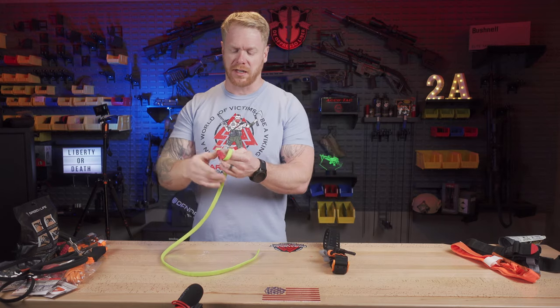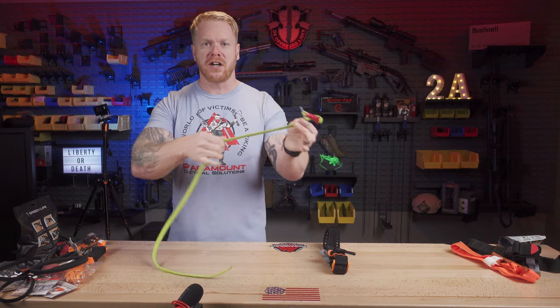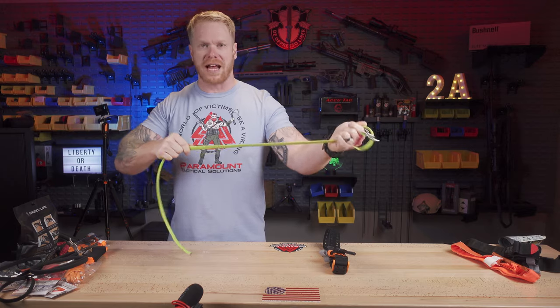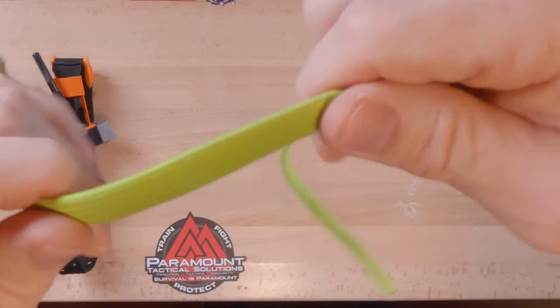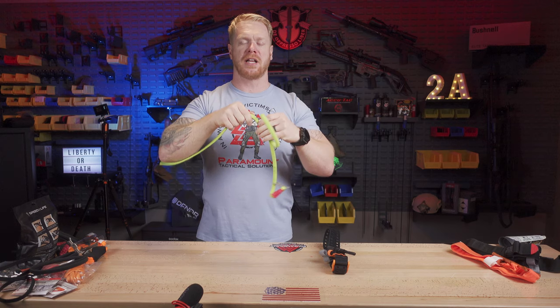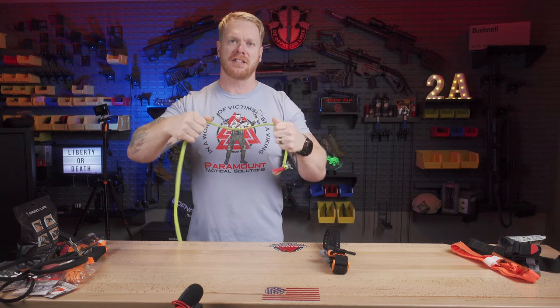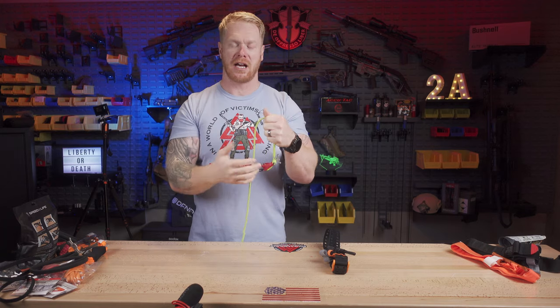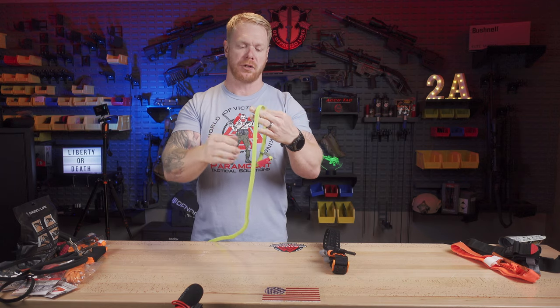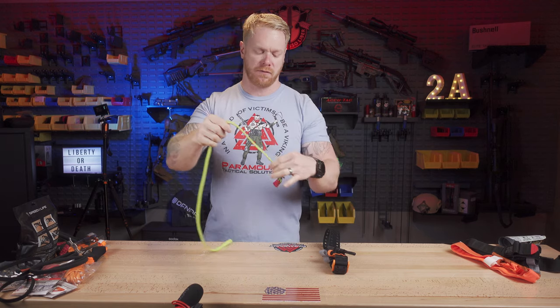So let's start with the RATS tourniquet — the Rapid Application Tourniquet System — and the SAM XT. The RATS is very unique and very different from a lot of tourniquets because it's basically a really strong elastic band. It has a very flat profile, so when you wrap it around you, that circumferential pressure is spread out over a larger area. And because it is elastic, every time you wrap it, you're providing more and more pressure, giving you good full occlusion of those blood vessels.